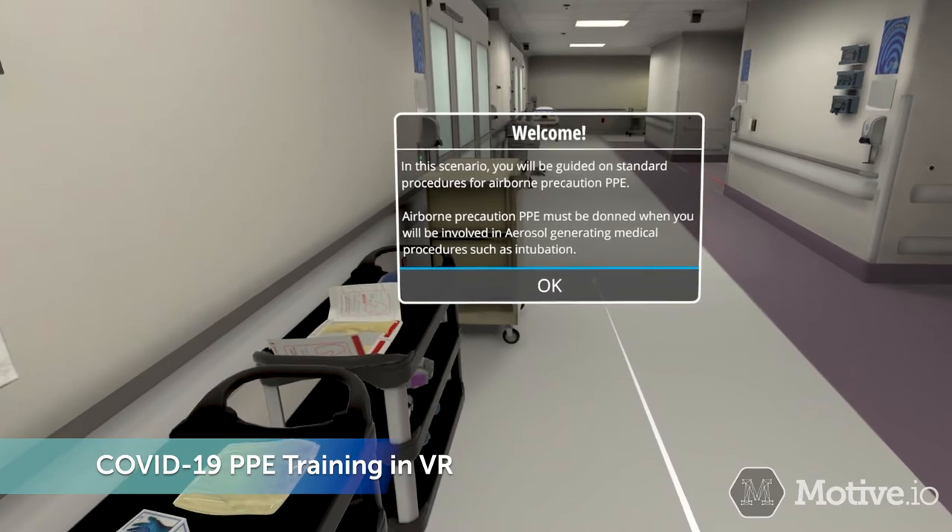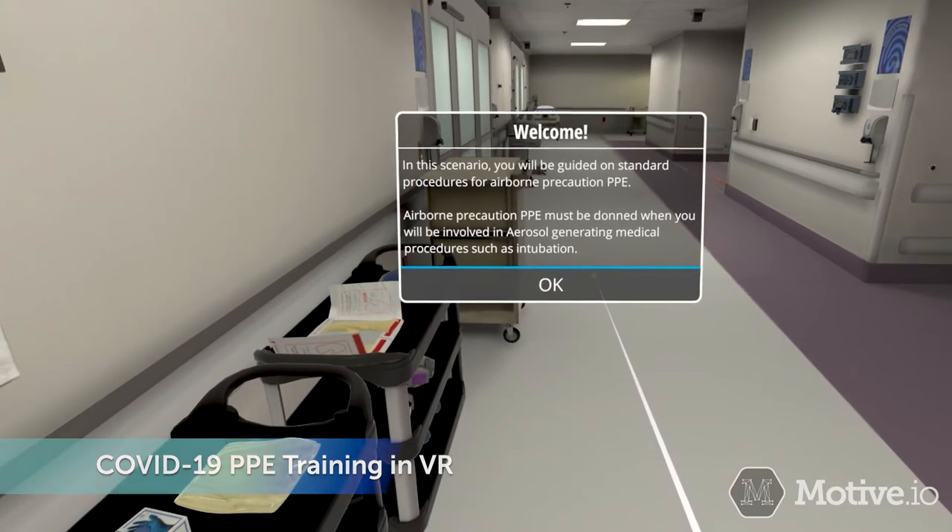In this scenario, you will be guided on standard procedures for airborne precaution PPE.